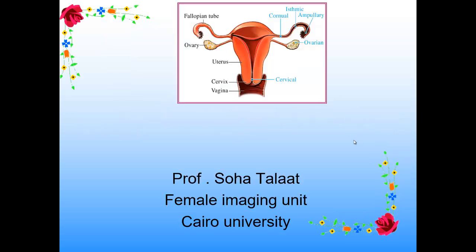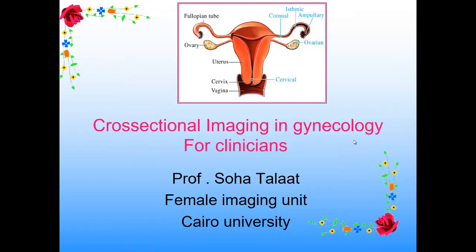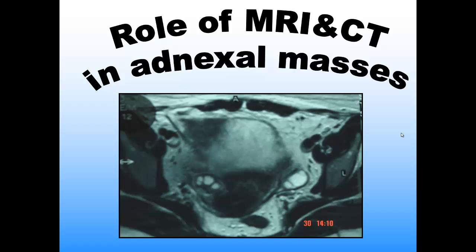Our lecture today will be on the role of MRI or cross-sectional imaging in gynecology, and this is for clinicians mainly, in order to know when to request CT, when to request MRI, and so on. First, we will start with the adnexal masses. The role of MRI and CT in adnexal masses.